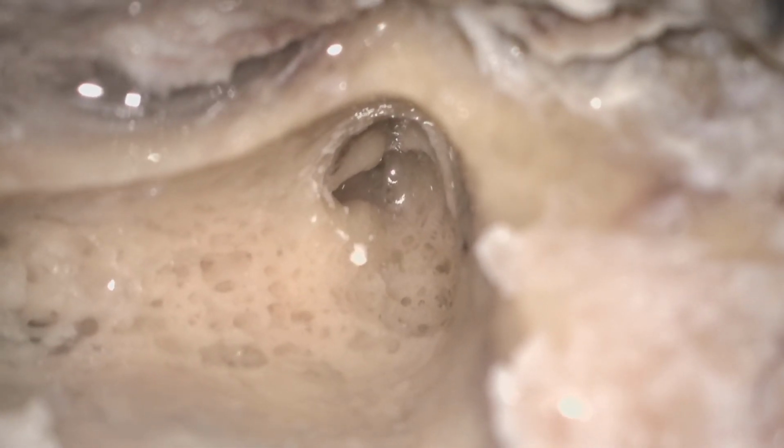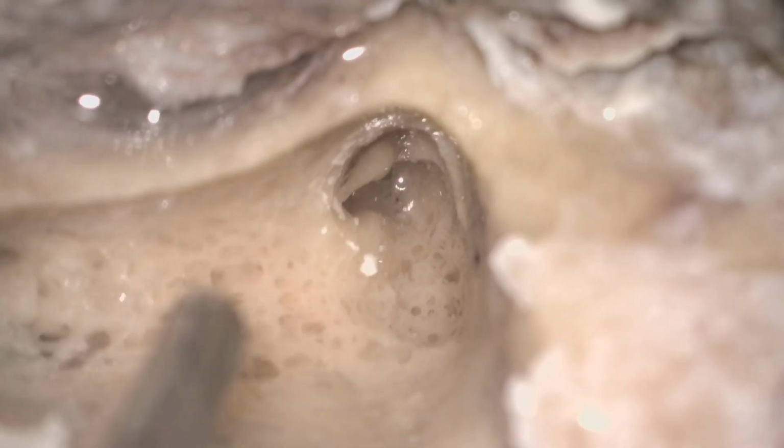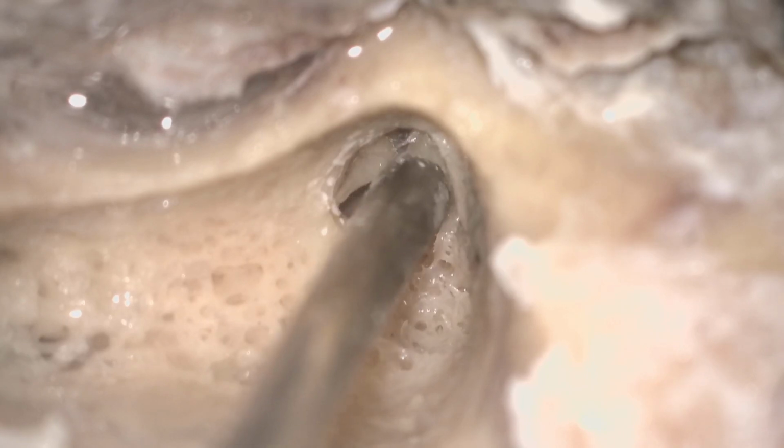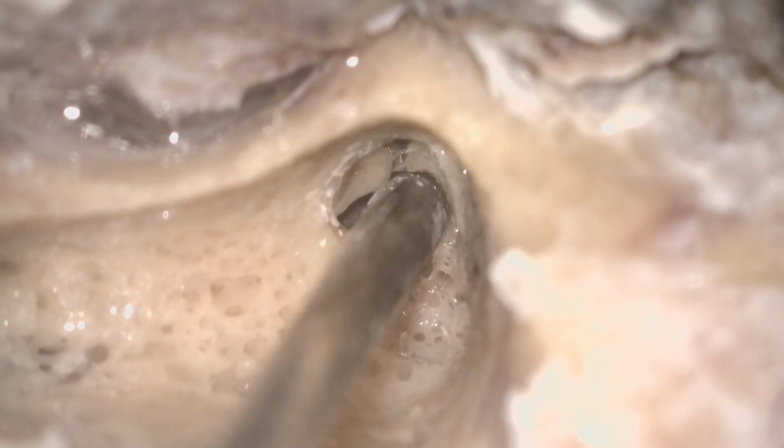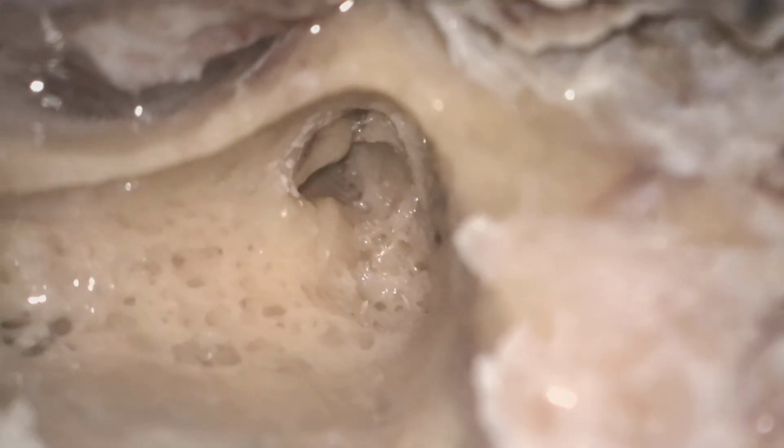Can you centralize it? Yeah, now you can visualize. So how beautiful the structure. This is the full incus, and look at the ventilation folds, the mucosal folds that have been attached to the incus, to the superiority. This is the superior incudal fold.